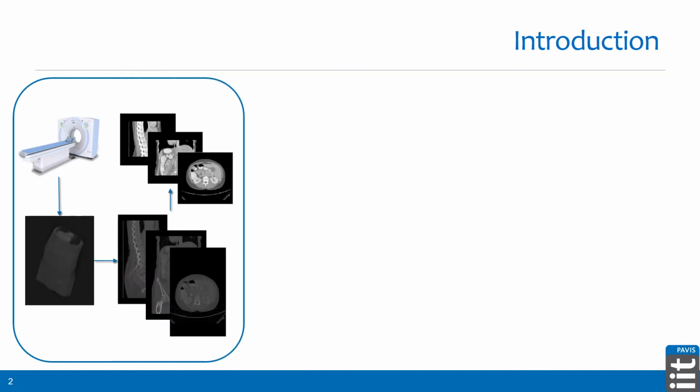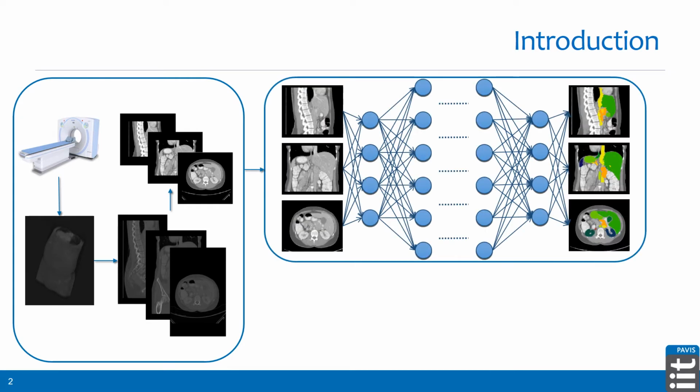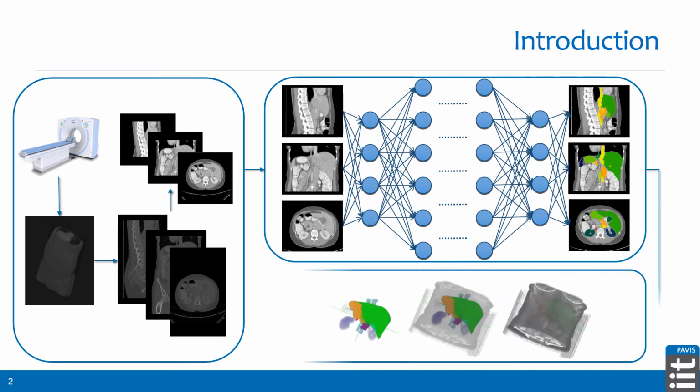These days, deep learning is an important tool in biomedical imaging as well. The story starts from the extraction of images from a CT or an MRI machine, which are then fed to a neural network for segmentation, and after learning, the model gives us the segmentation masks.